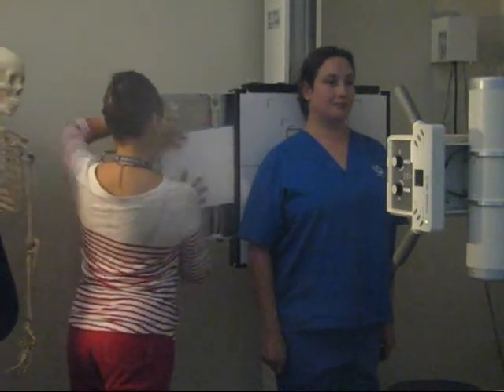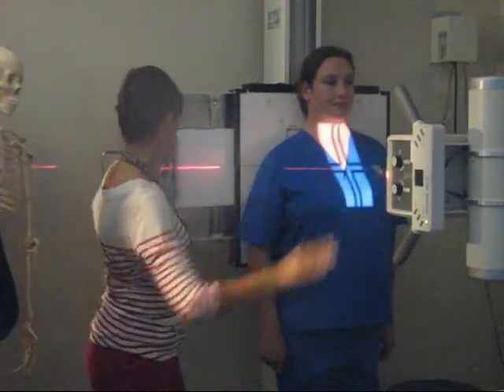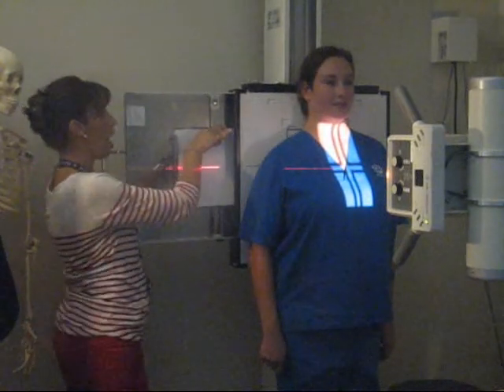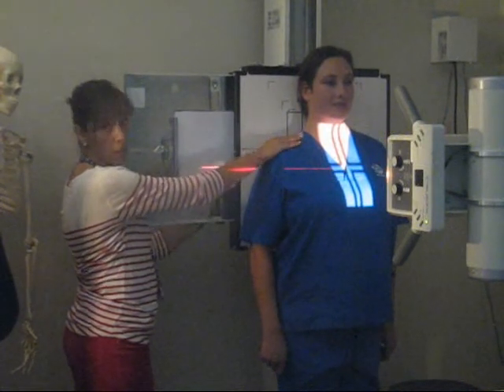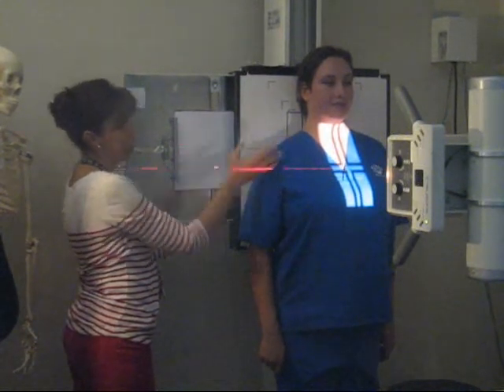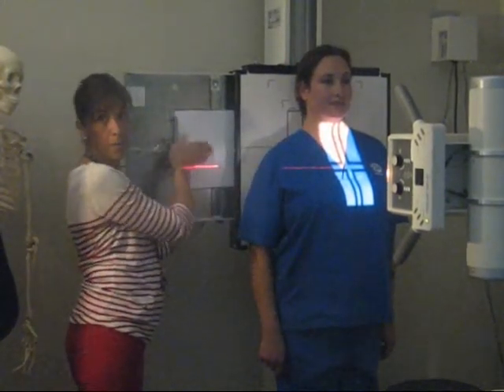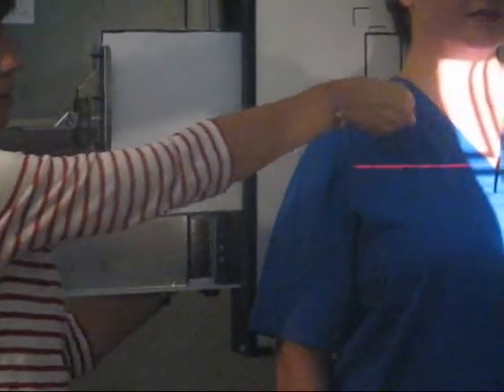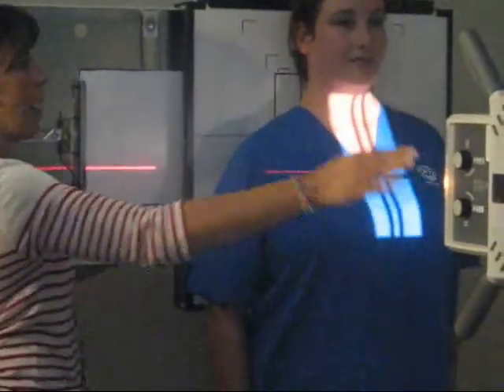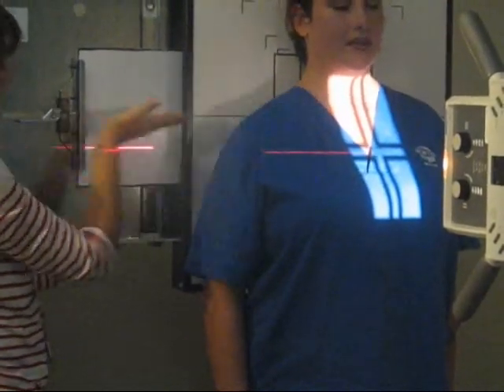Okay, so you're going to want to bring the top of the cassette about 2 inches above the shoulder. Okay? In this case, you want the clavicle as close as possible to the middle of the cassette, and since the clavicle is a long, thin, lengthwise or crosswise bone, you about want the middle ray across it.